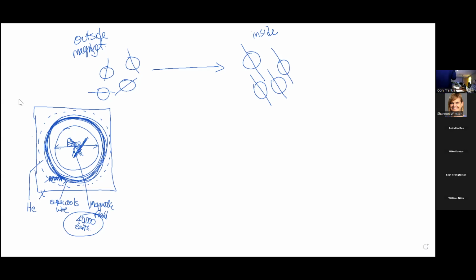So the accidents that happen with an MRI scanner are when someone goes in there, when there happens to be a patient in there, or sometimes not, and they take ferromagnetic metal and it's going to go to the center of the bore. It can be big things like someone's delivering a desk and they've got the wrong room number. It can be small things like a hammer, an oxygen tank, whatever it's going to be, it's going to go straight into the bore, and you're not going to be able to stop it. So one of the reasons we've got all these zone 1, zone 2, zone 3, zone 4, all that stuff is you don't want to take ferromagnetic metal in.